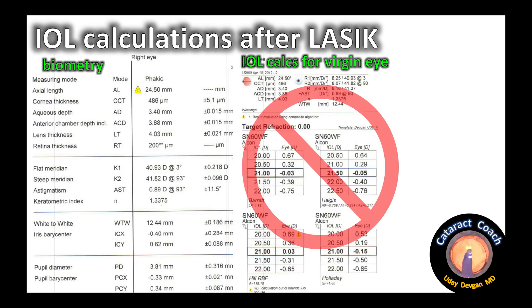This page is from our biometer, where we measure, importantly, the axial length of the eye. It also shows central corneal thickness — here 486 microns, consistent with the previous two devices. It also gives anterior chamber depth, lens thickness, and corneal powers. These corneal powers are reading a little higher than the other machines because this device doesn't take prior LASIK into account and uses a different measurement method.